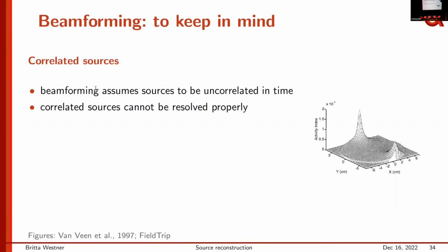But of course, those models take a long time to compute. So there you then have that problem that you buy. So also here, it's a bit of a trade-off between getting a solution that is as realistic as possible, but still being able to solve it and not spend more time than necessary in the computation. This intersection is like a technical problem.